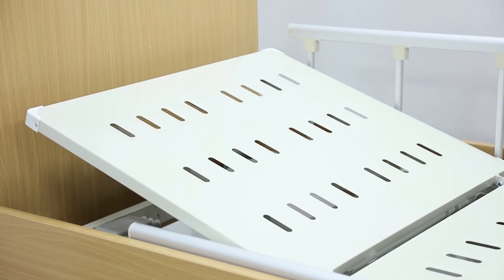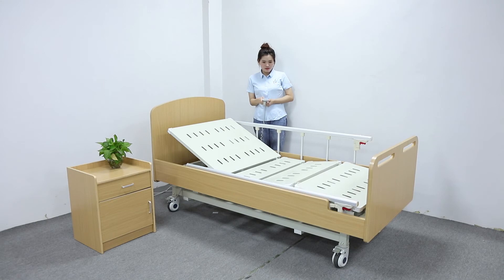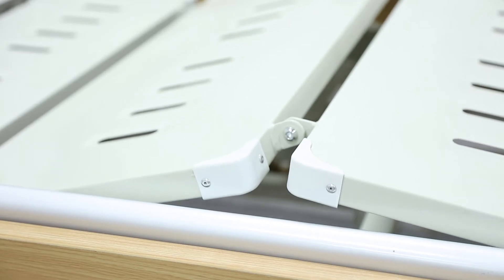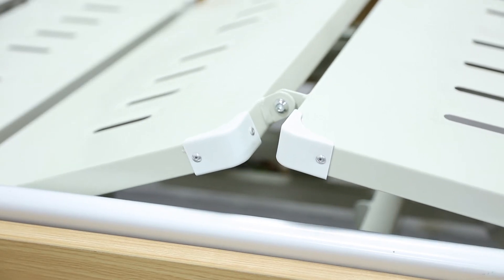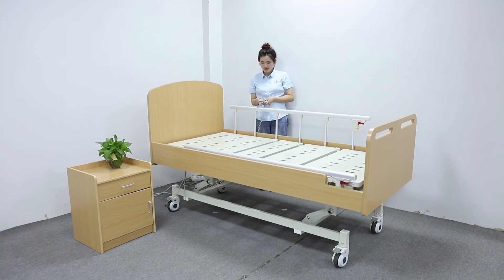The self-contained motor is quiet when running to reduce disturbance. It has three adjustments: head or back, foot, and height adjustments. The wood head and foot board color can match the room environment.